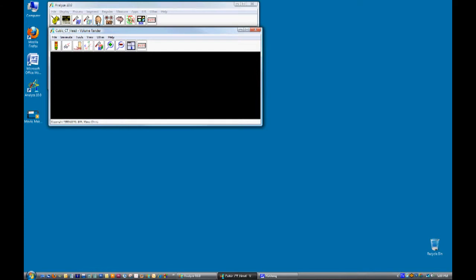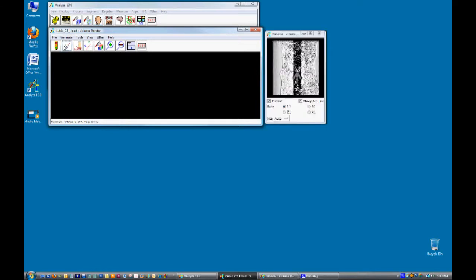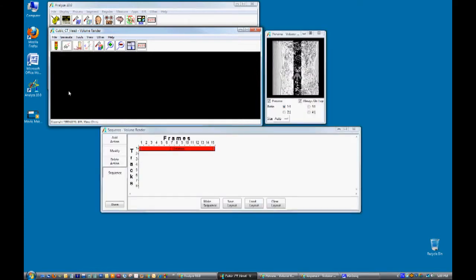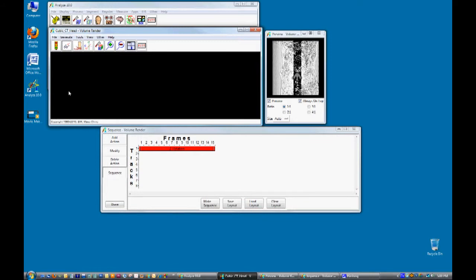In the volume render module open up the preview window and then the sequence tool. By default a Z rotation action is already available in the sequence tool.